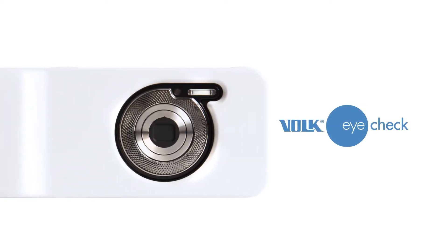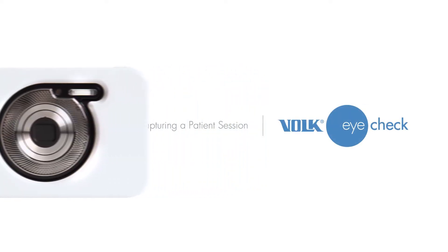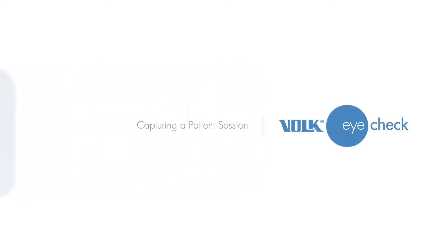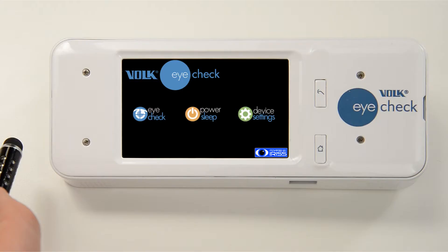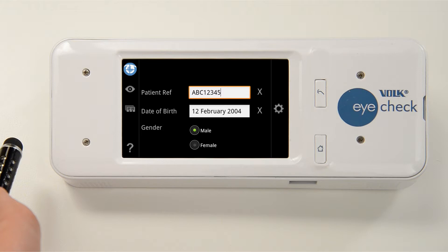Capturing a Patient Session. To begin a measurement session, touch the eye check icon from the home screen. Input a patient ID, date of birth, and gender. Touch the black and gray eye icon to start a session.